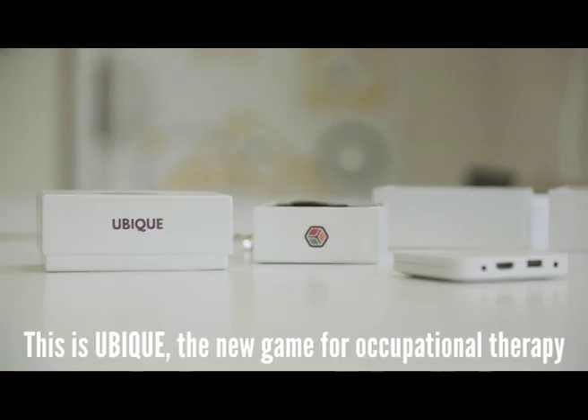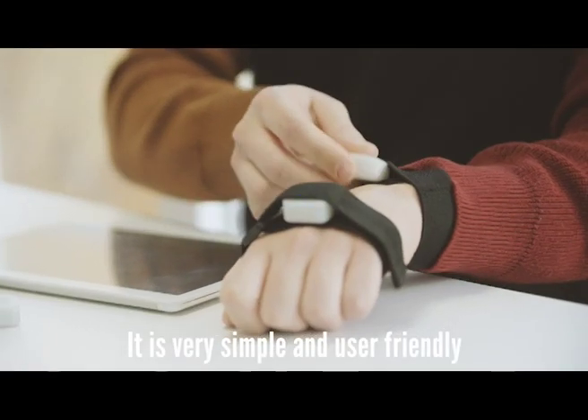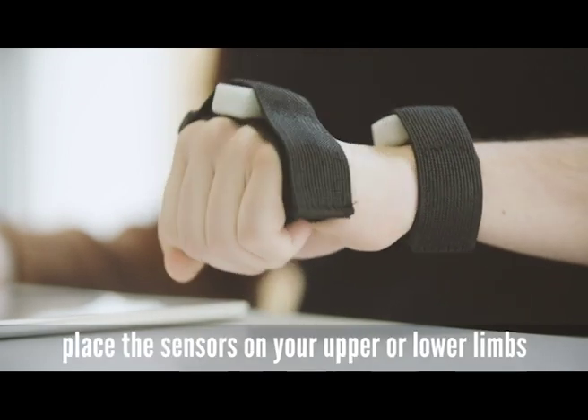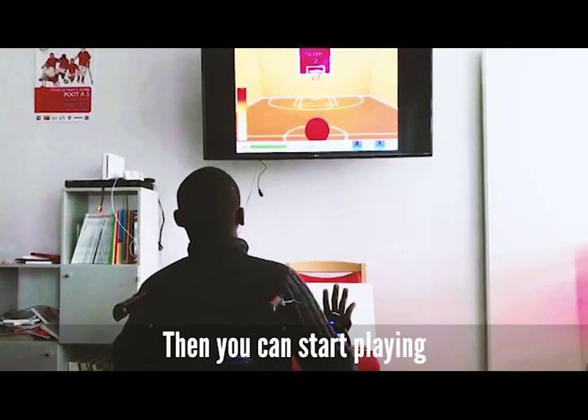Hey guys! Let me show you something. This is Ubik, the new video game for occupational therapy. It is very simple and user-friendly. All you need to do is place the sensors on your upper or lower limbs and choose a movement you wish to exercise. Then you can start playing!